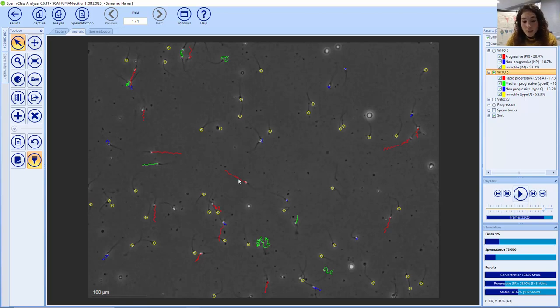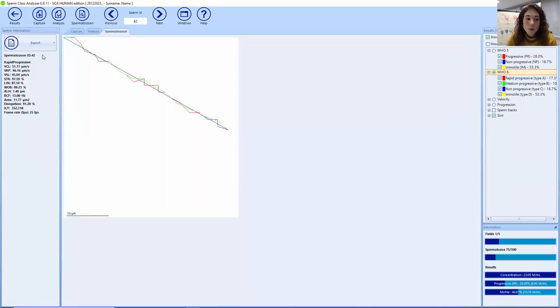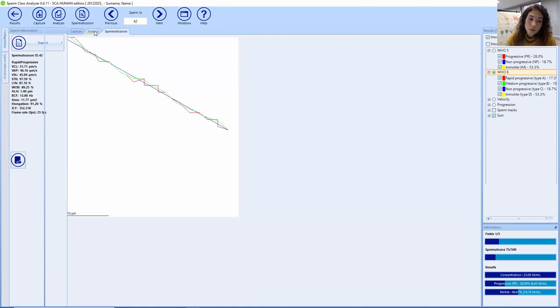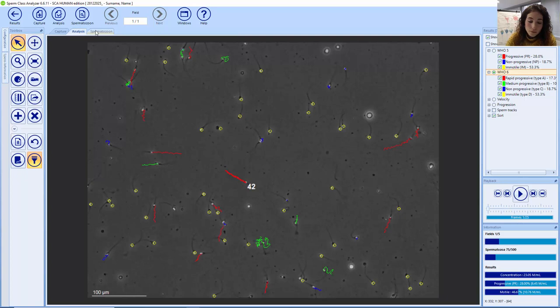If you double-click on one sperm, you can check which category it corresponds to. This same functionality is also available in the SCA Scope.